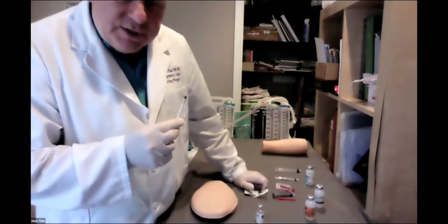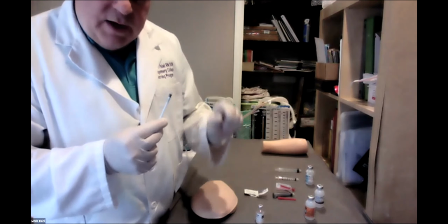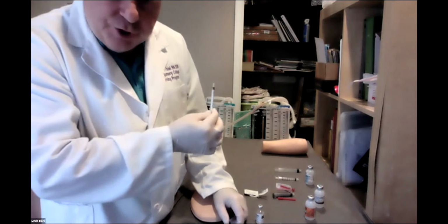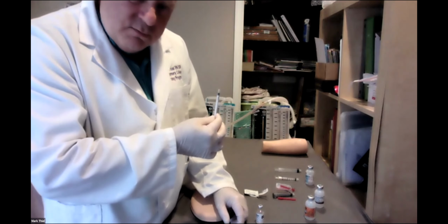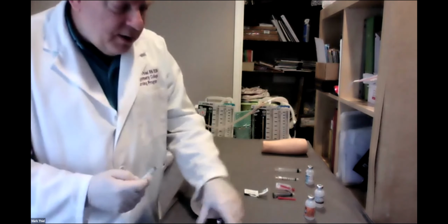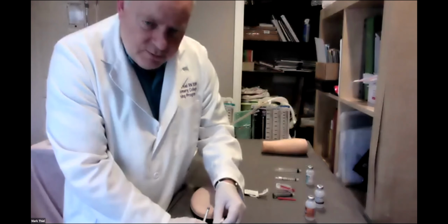I will be injecting today. I don't have one, and I don't have that needle situation where it's selected for me. I just want you to envision that this is my insulin syringe. I spent the extra time, as I was describing, to go slowly through the intramuscular preparation.